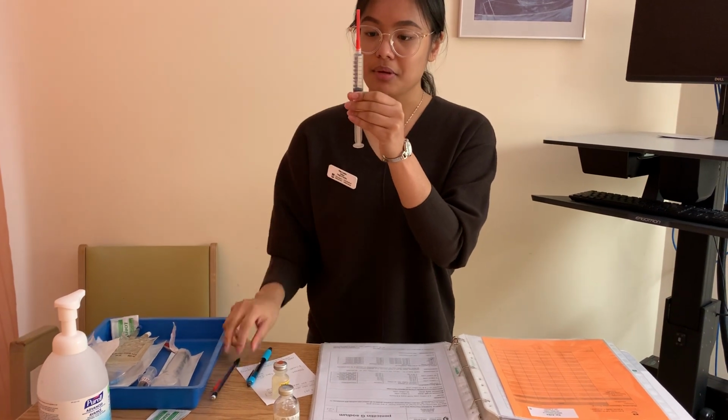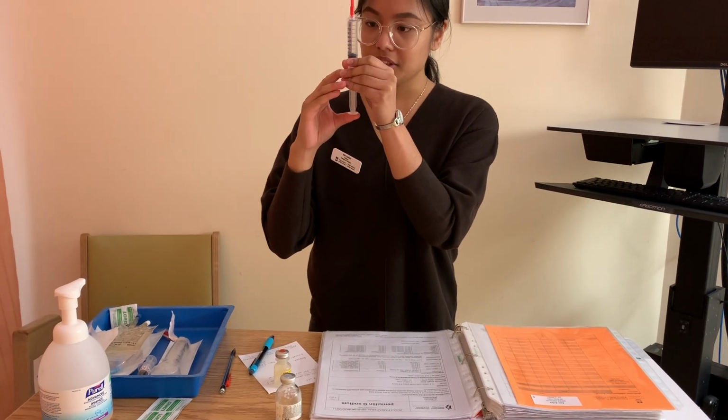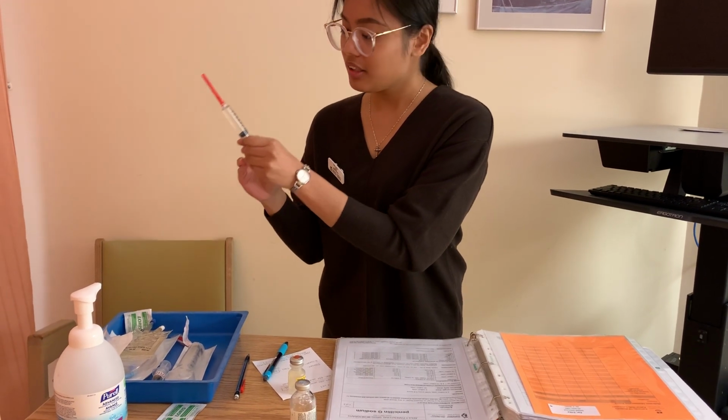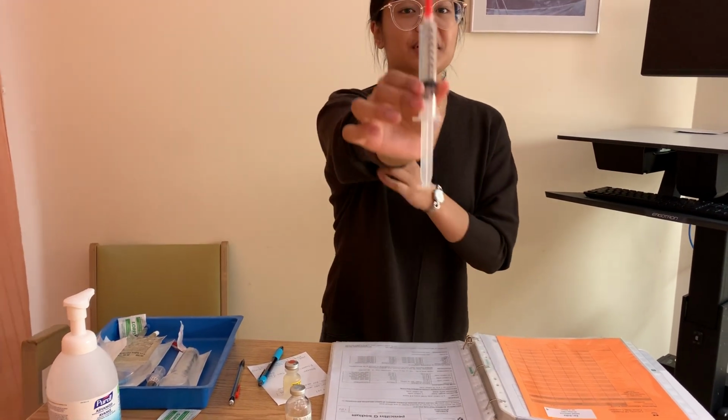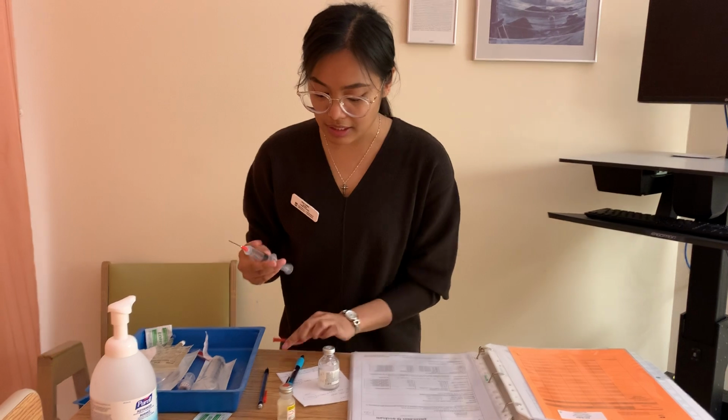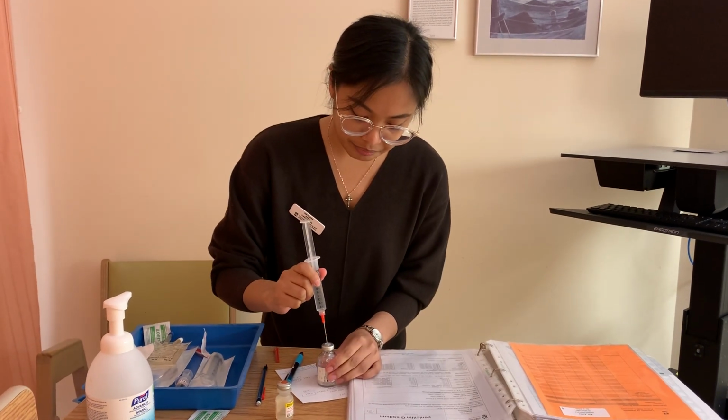And so there's no air bubbles. I'm just going to recalibrate that to 8.2. And I would have put the rest of the fluids in the sink. So here I have 8.2. Now I know that my medication is still not contaminated at the top, so I'm just going to inject it in.